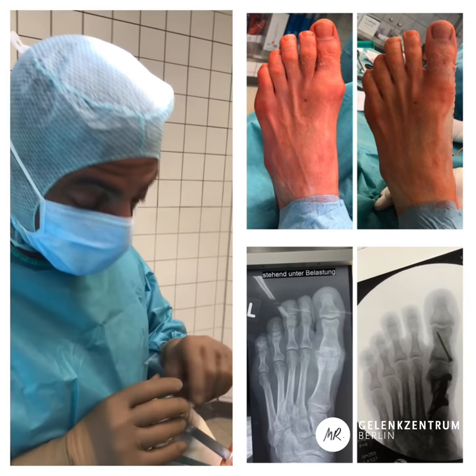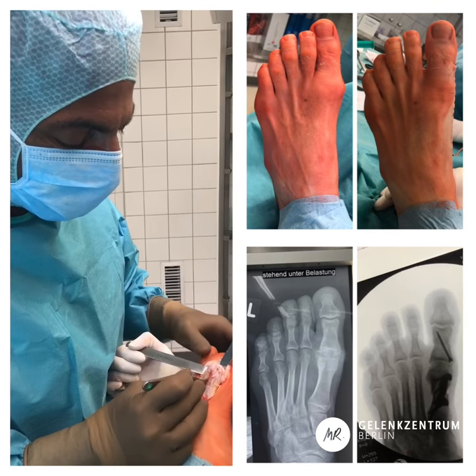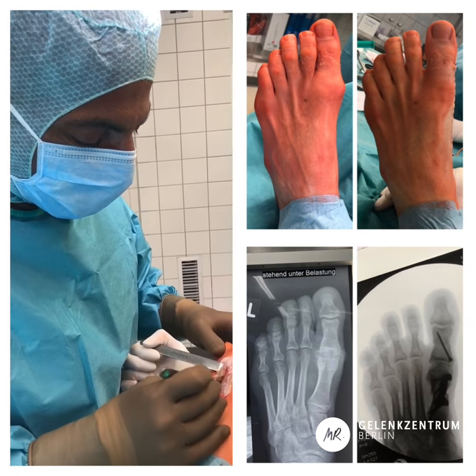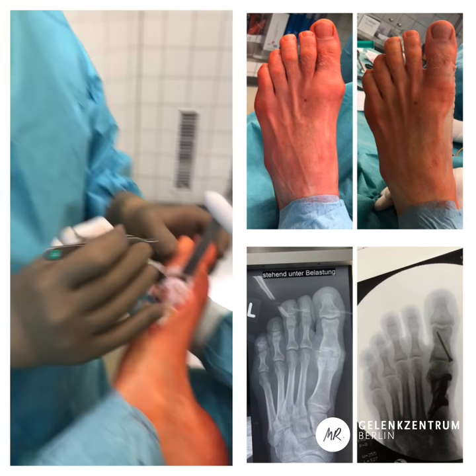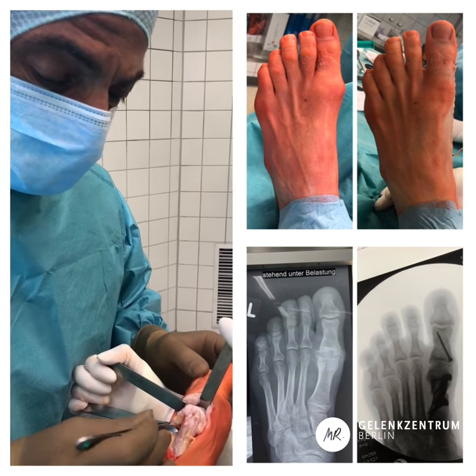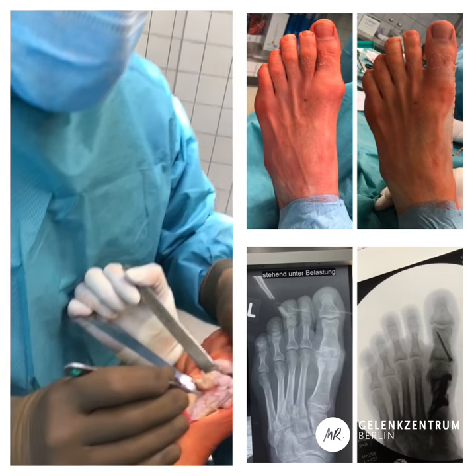He has a massive hallux rigidus and we see here these osteophytes, which we are going to remove. Besides that, he has an overlength of the first ray, so the metatarsal is going to be shortened so that the first toe is equalized to the others — it is much too long, as you're going to see in the preoperative photos. This is a massive finding.